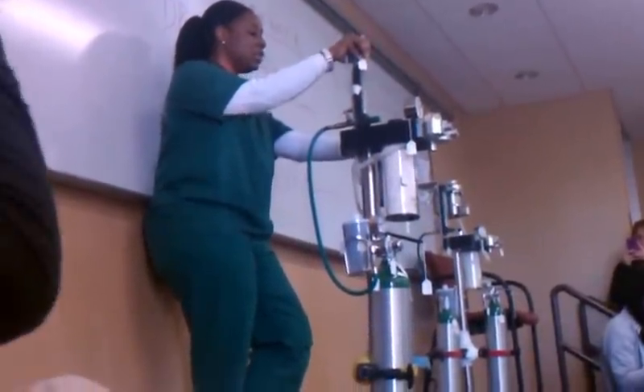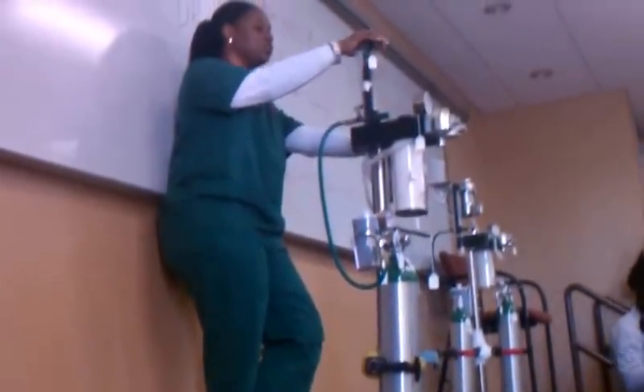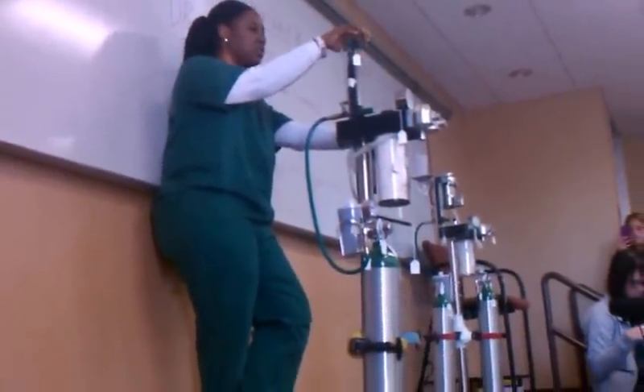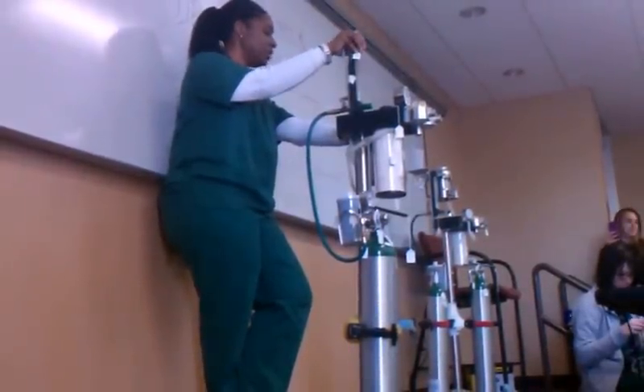Now we're going to learn how to hook up this same machine with a non-rebreathing system. We will choose a non-rebreathing system for small patients — those that weigh less than 7 kilograms, less than 15 pounds.